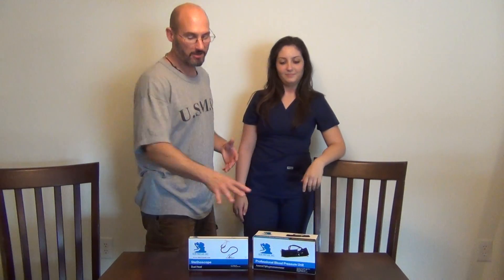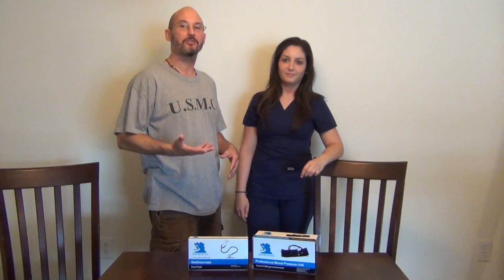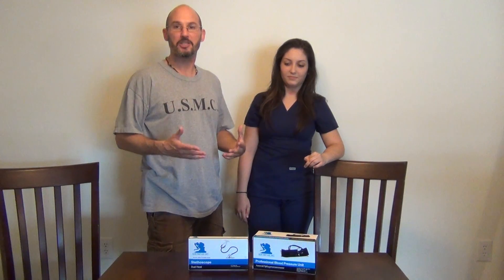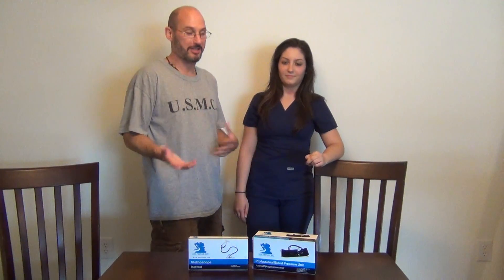The reason I want Alicia's help is she's a nursing student. One of the first things they learn in nursing school, right in the beginning, is how to use these two instruments to check your blood pressure. You can buy these at readycampingsurvival.com, and they're really easy to use. That's why they learn it as one of the first things — it's an important part of your overall preparedness plan. And Alicia's going to show you how simple they are to use. And before this, they were a mystery to me. So Alicia, can you help us out here and show us how they work?